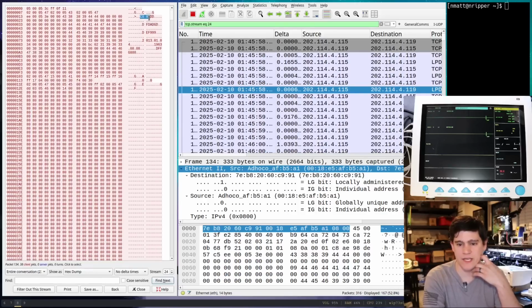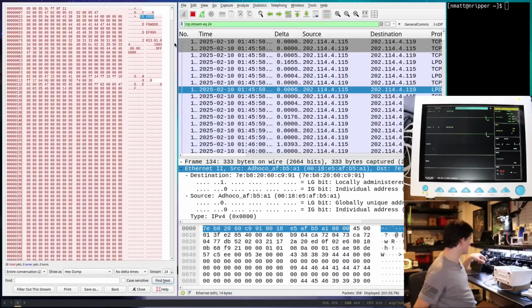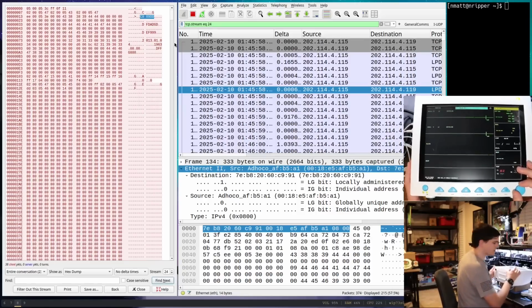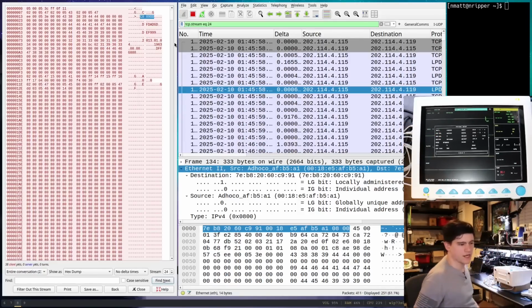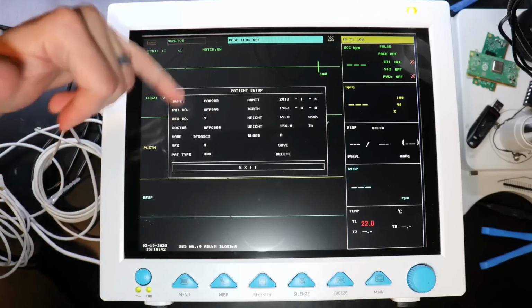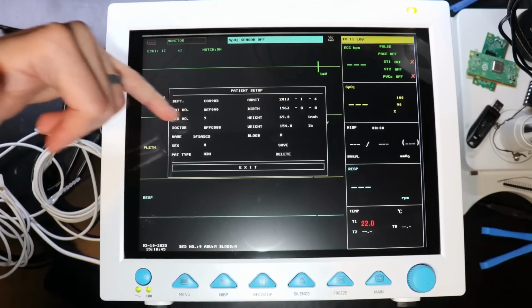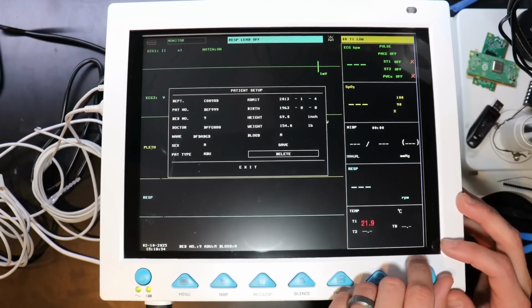So this says C889DD. That is a piece of clear text data among some other binary data. If we look over here on the patient monitor, we can go to menu and then look at patient setup. You probably can't see that, so let's go to the desk view. There we go. We can see right here that this is related to the department, patient number, bed number, doctor, identifiers there. That data is getting sent in clear text, very obviously. We're going to exit out of that menu.